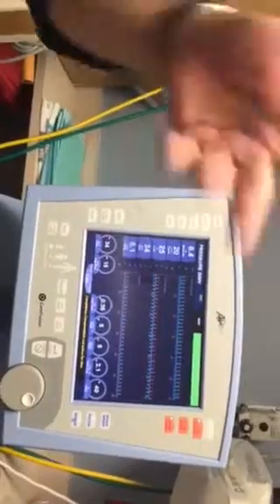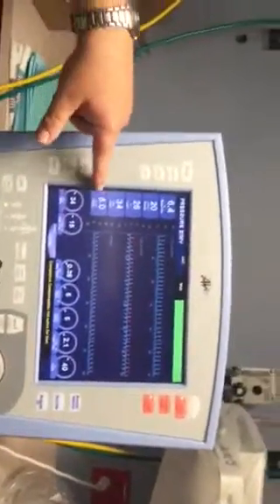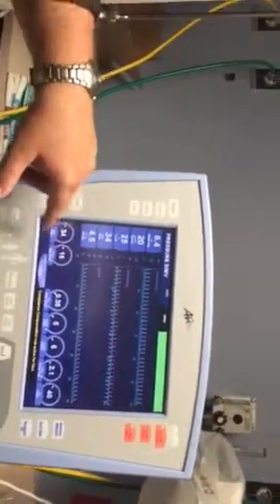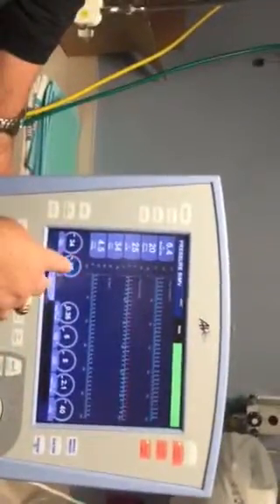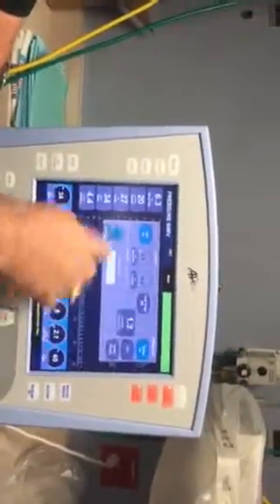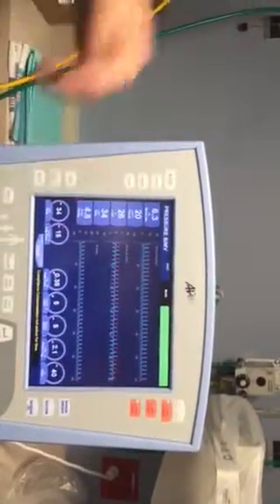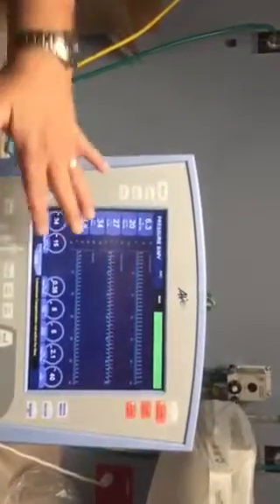So, I put this baby on 20/5. You need to be conversant with the doc and say, hey, I'm getting... That's not good. I'm getting 4.8 cc's per kilogram. We want to be between 4 and 6. Okay, but I'm happy with that.